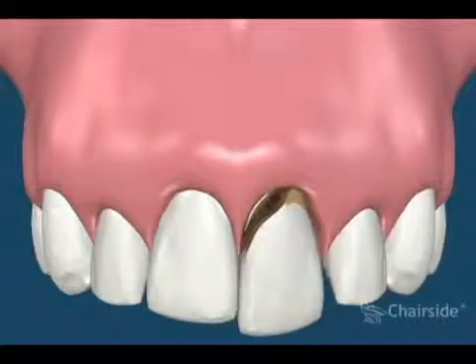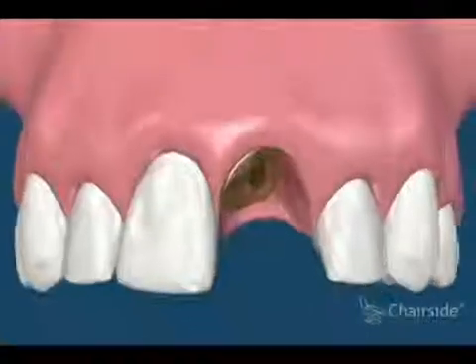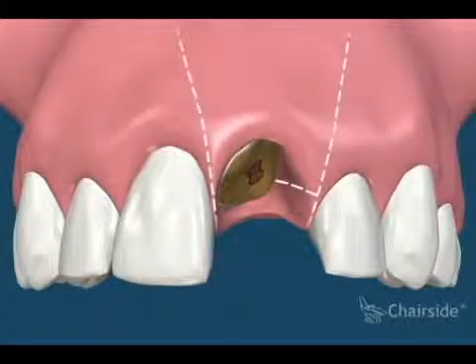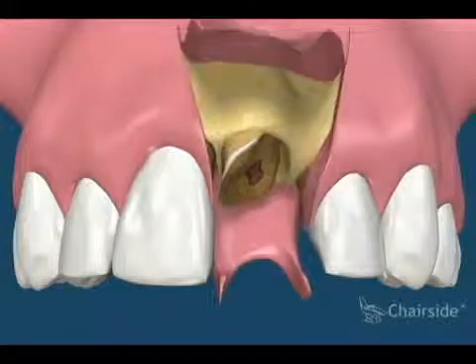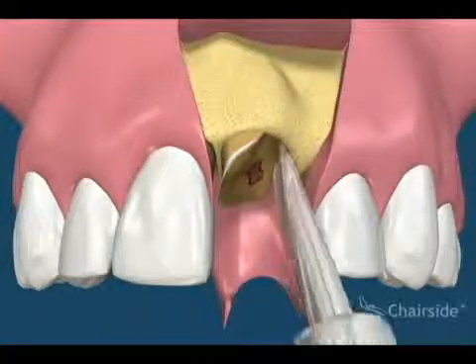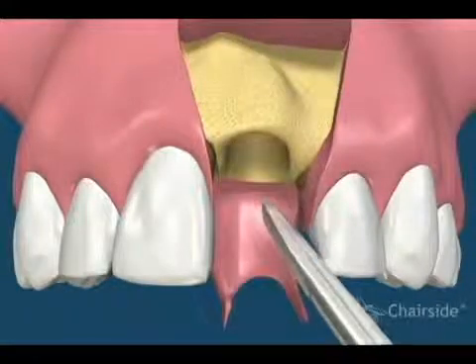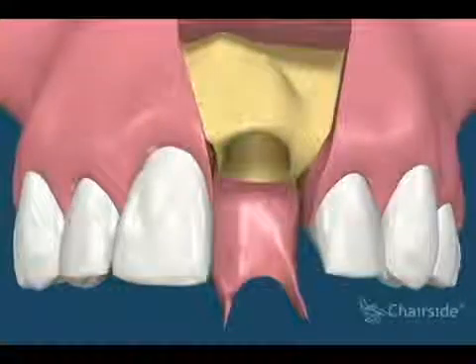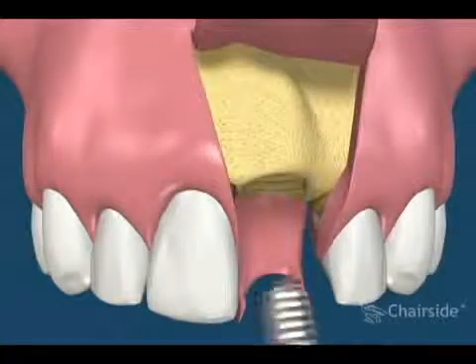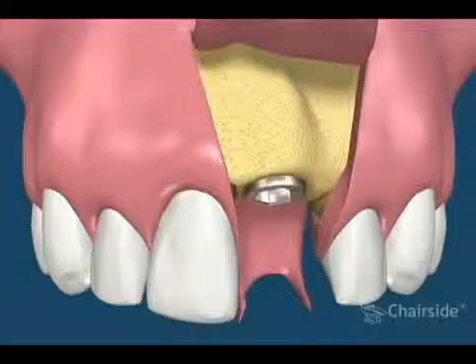This shows the extraction of a broken tooth with an implant being placed at the same time as the extraction. The gum is reflected and the tooth is carefully removed without damaging more bone. The void created by the tooth root is now ready to be prepared, and the implant fixture is then placed into this prepared site.